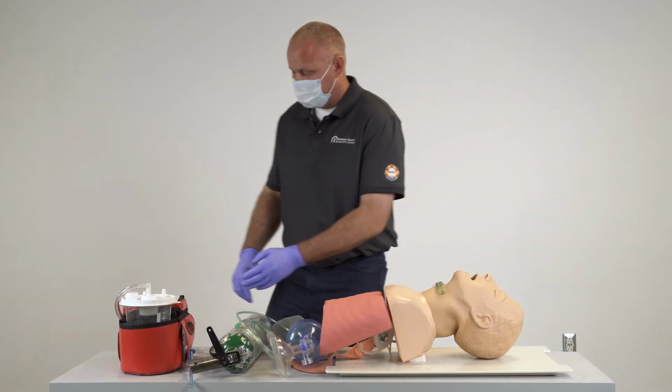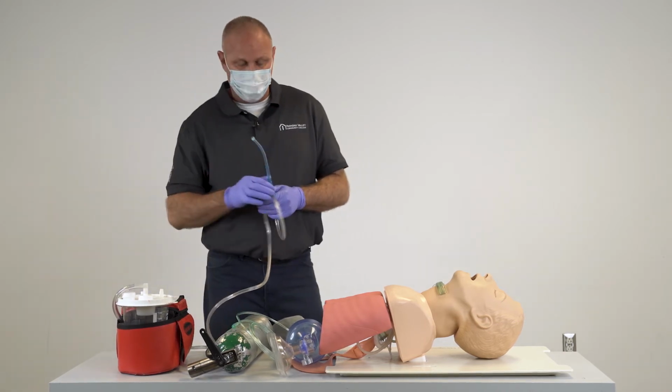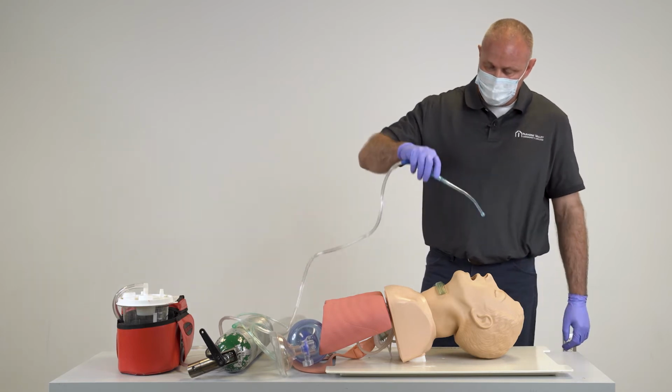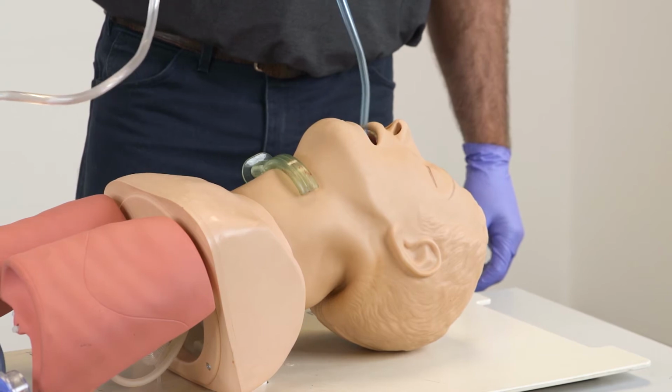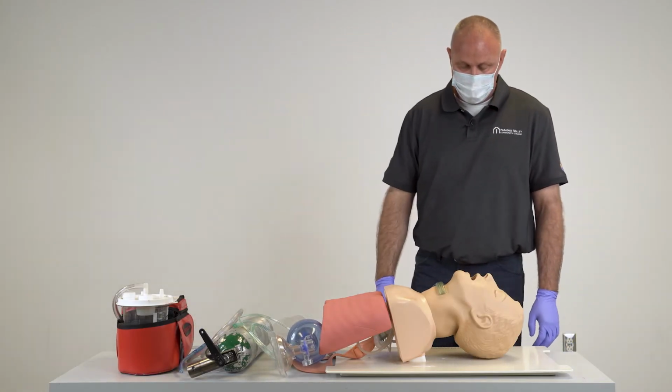Okay, now I want to take my suction unit. I'm going to grab my rigid catheter. I'm going to turn my suction unit on. I'm going to place my catheter in as far as I can see, not closing the port. Once I'm inside, I'm going to close my port and suction in a circular motion on the way out, no more than 15 seconds. Is my airway clear? The mouth and oropharynx are clear.